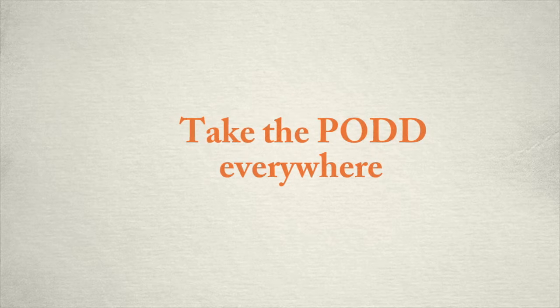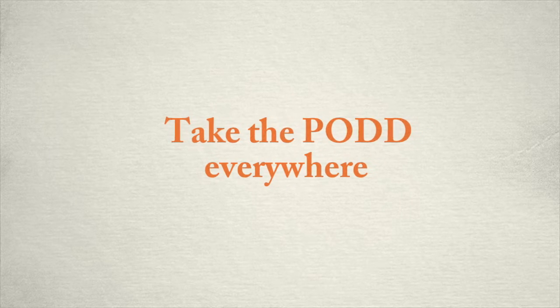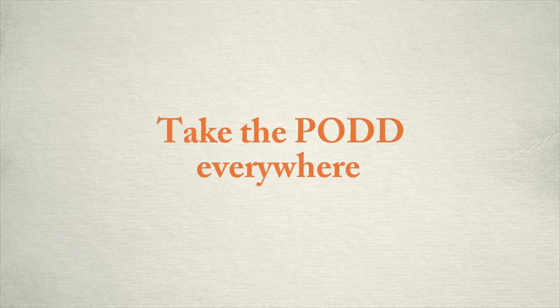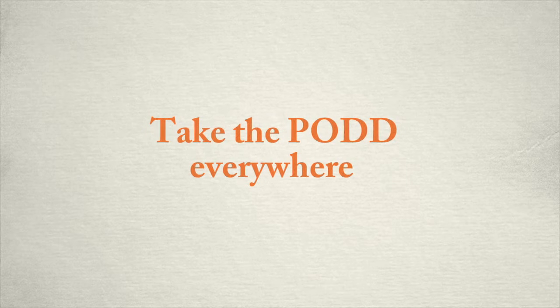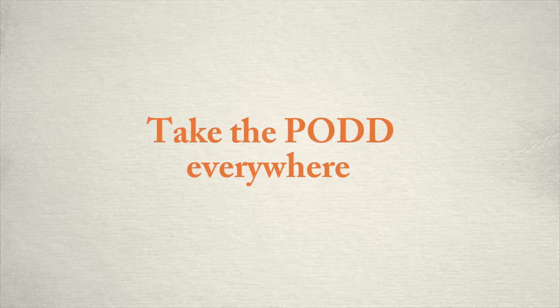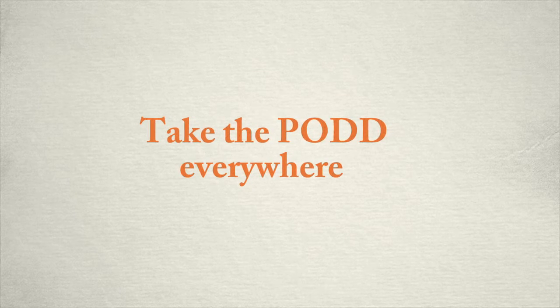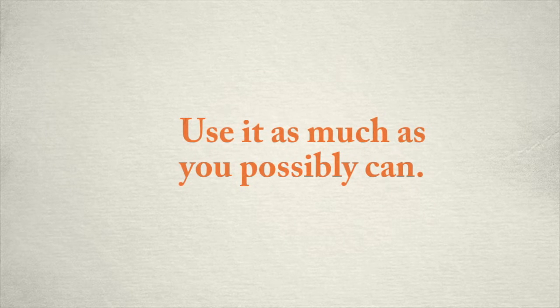Taking the PODD everywhere is the very first step of using the PODD. Take it to the grocery store, grandma's house, church, the bathroom, bedtime, everywhere. When children are learning to speak, we don't stop talking to them, exposing them to language, or take away their voice. The PODD is their voice, so it needs to be wherever they are.